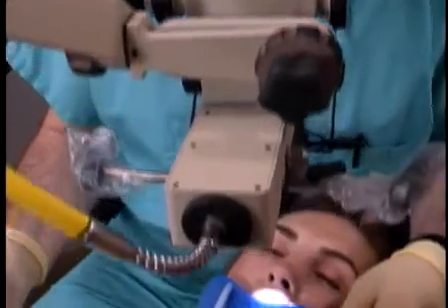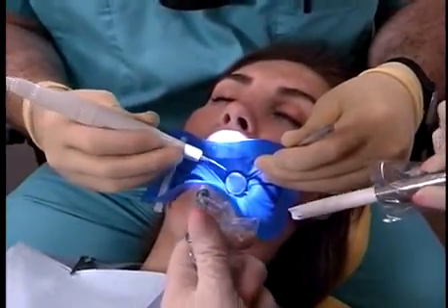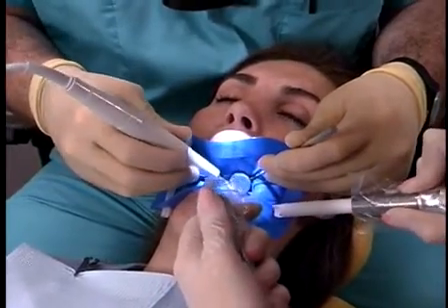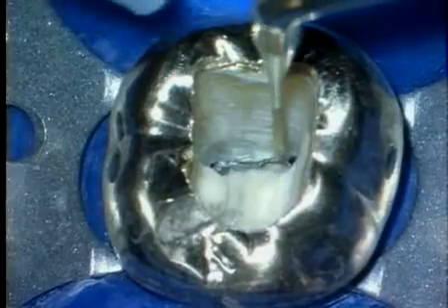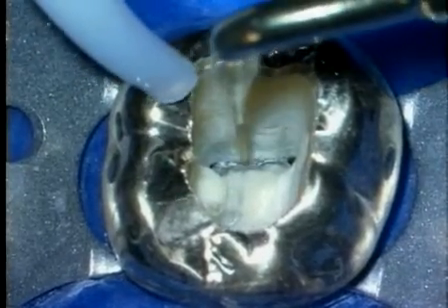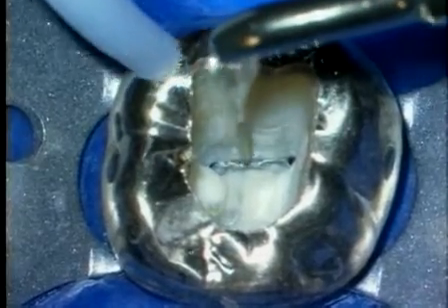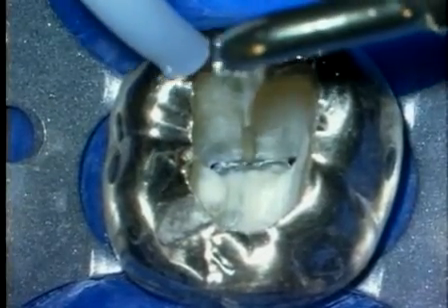Microscopes, in combination with ultrasonics, allow us to perform microsonic techniques. Notice the assistant using continuous air as we sand away tooth structure precisely. This gives us an unobstructed line of sight. When using the endo tip number 3, set the power on the P5 at about 6 or 7.